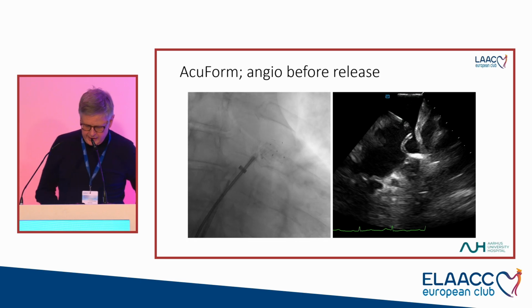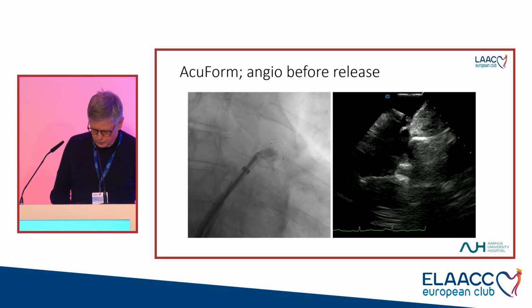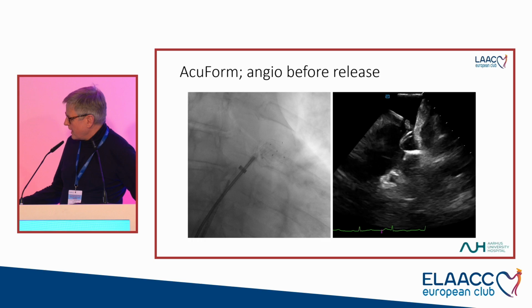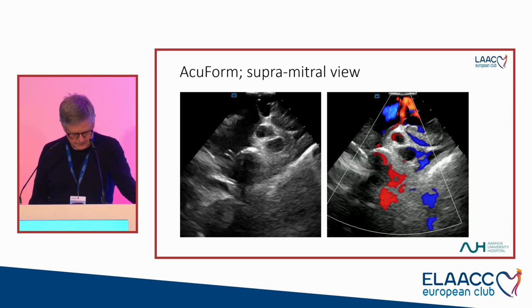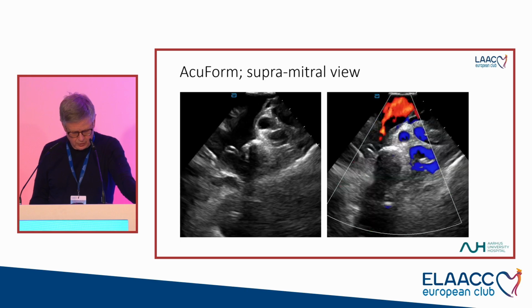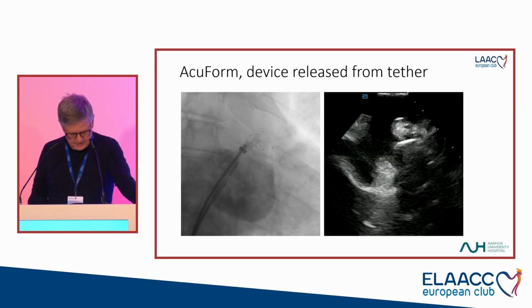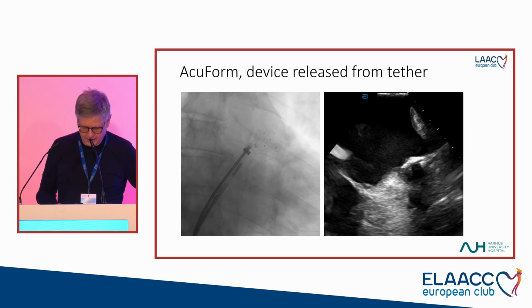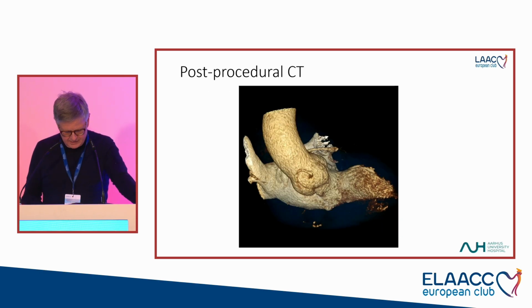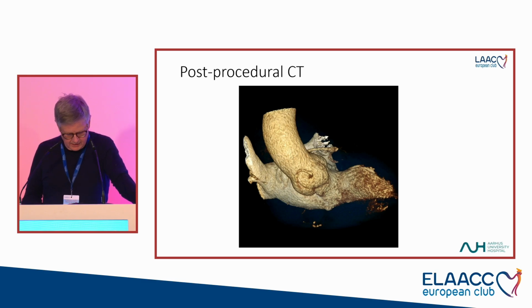So before the release, we have to go through all the criteria, also the sealing criteria. And one thing that is nice with the device here is that you can do angio here on what is called the pusher catheter, and due to this ePTFE, there will be almost immediate sealing with this device. Before final release, we have to go through all the 3 ICE positions. So this is a supramitral view, looking at the conformal device, and again, final angio here for the second deployment. And to the right-hand side, the tether has been released from the device, and that's the final position. And patients come back 45 days after implant, and this is the appearance.